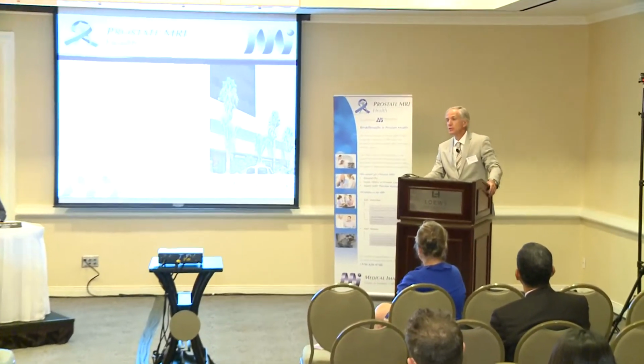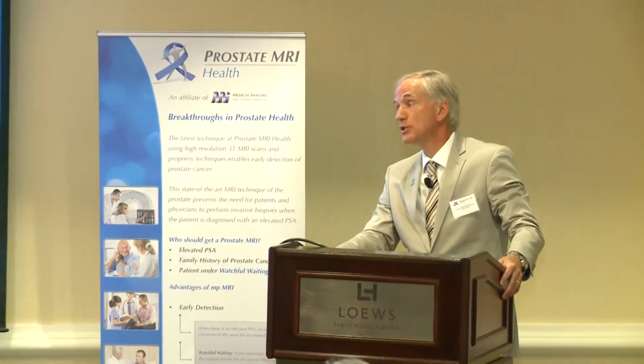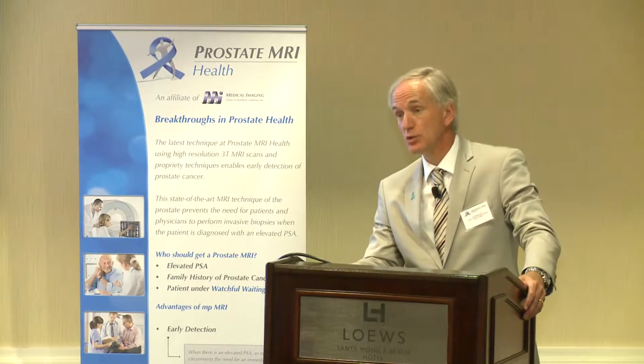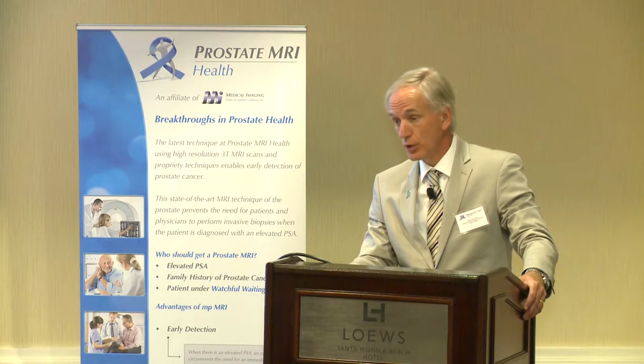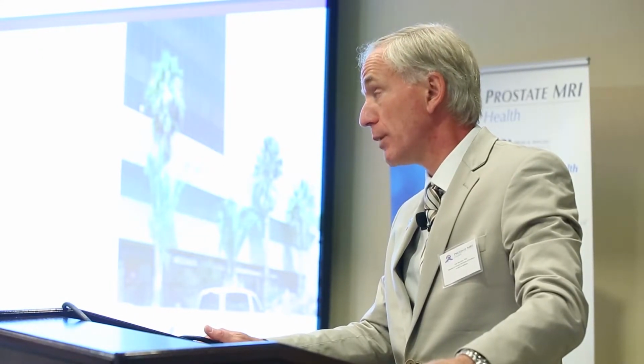To start with the last question, first of all, are we talking about patients who had an MRI screening, or patients who had just a TRUS biopsy? They had a TRUS biopsy. They're proven 3+3. I do the MRI, and I don't see, quote unquote, a significant cancer. I give them a 1 or a 2. And I'm going to follow them next year. Okay, so first of all, if you do MRI, you have a fair chance of 20% that you have an upgrade with MR. But let's assume you have a Gleason 3+3. The chance that you develop a cancer within 5 years is very low. To be sure, I think it should be advised to do a yearly MRI.